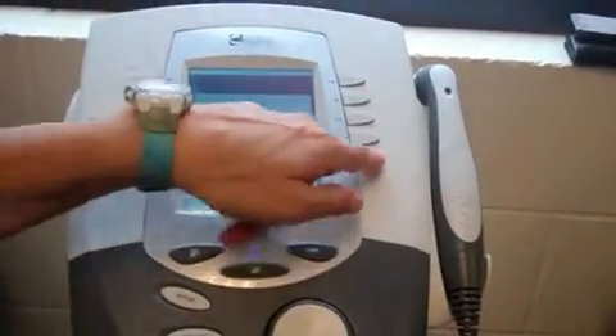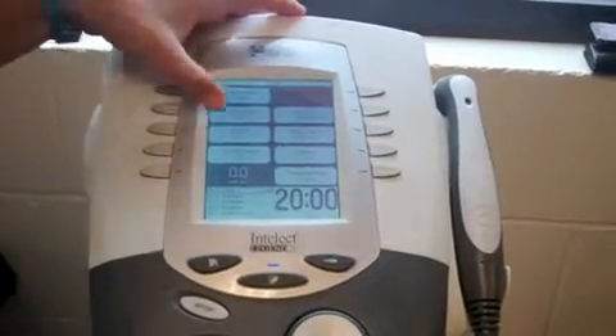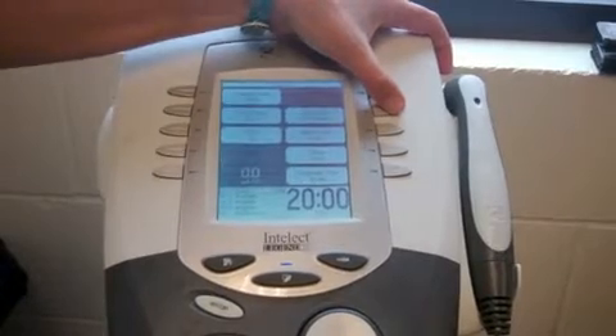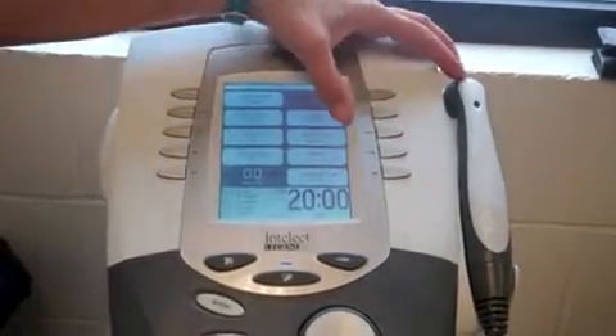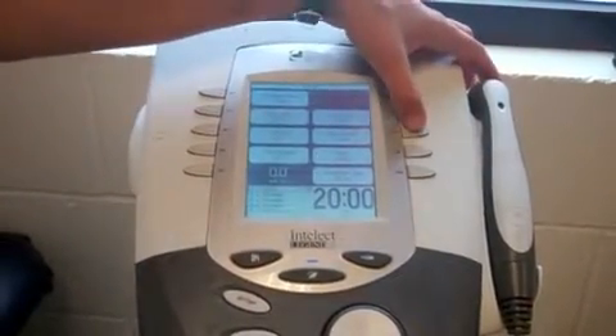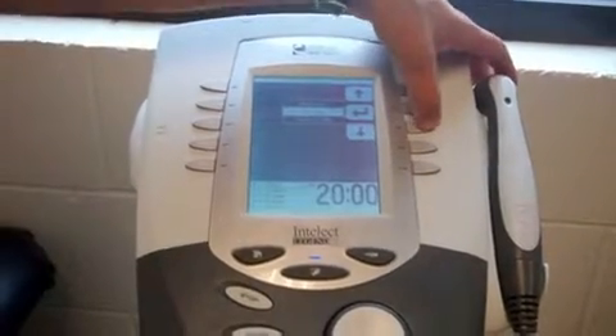We're going to edit our parameters. We want to have a cycle time of 10 to 10, and our frequency needs to be below 50, so we're going to drop it just a little bit.